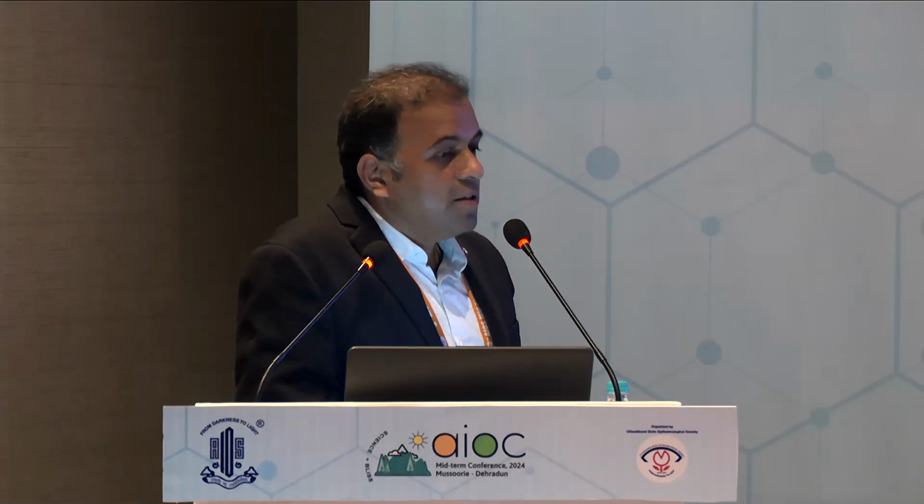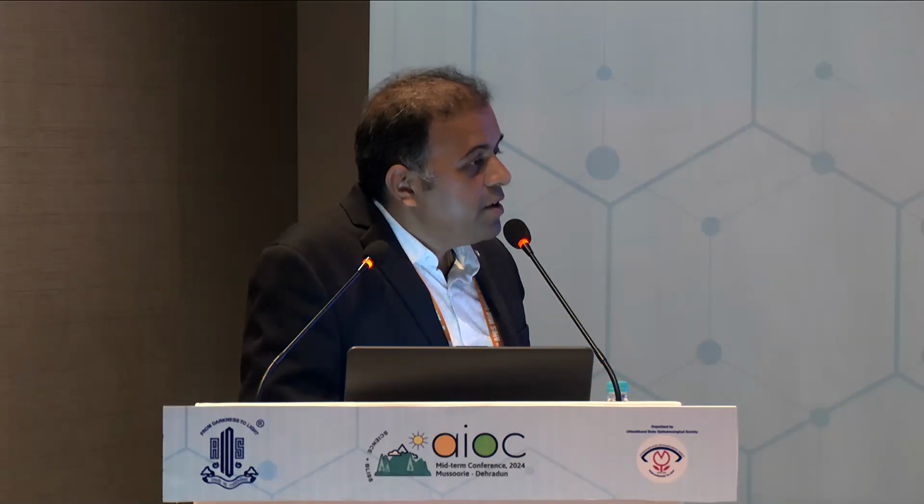After that I researched and studied a lot, and many seniors advised me that cases where we have done a preoperative vitrectomy, eyes which underwent a vitrectomy, eyes with high myopia, then high hypermetropia eyes, where we are operating under high anterior chamber pressure or operative IOP, are more prone to this. And other eyes like post-traumatic cataracts, eyes which have suffered some kind of trauma with zonulopathy, are generally prone to fluid misdirection syndrome.